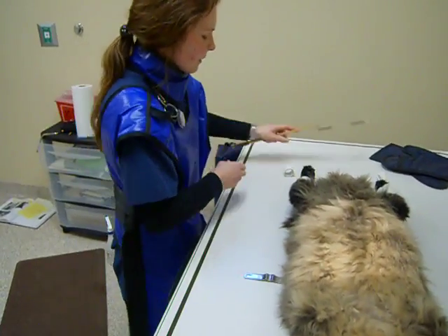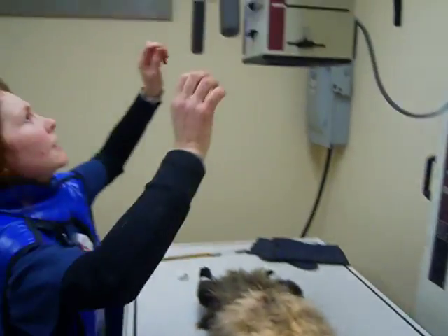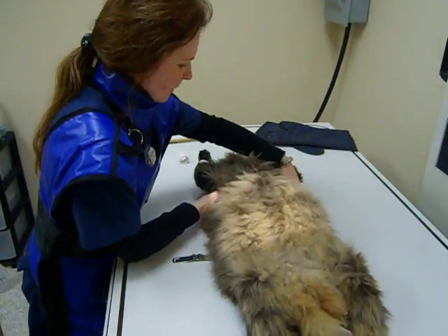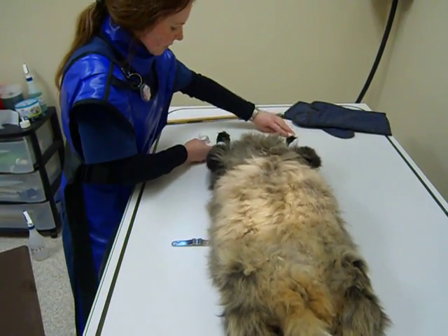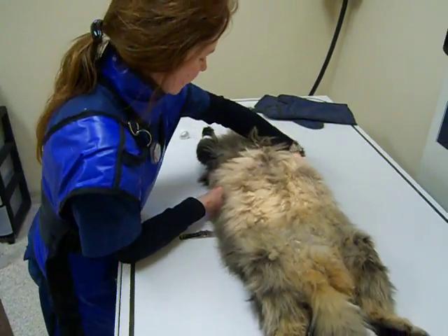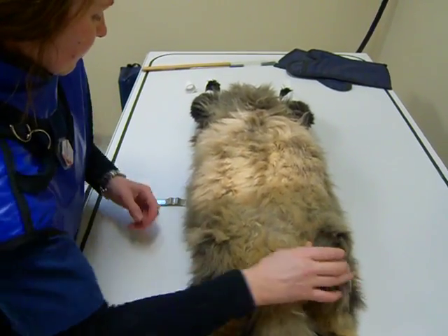Again, we refer to our exposure chart and we'll set our KV and MAS on the machine. We have him positioned in ventral dorsal and make sure his forelimbs are pulled forward so they don't obscure the field of view, keeping him as symmetrical and as parallel as possible.